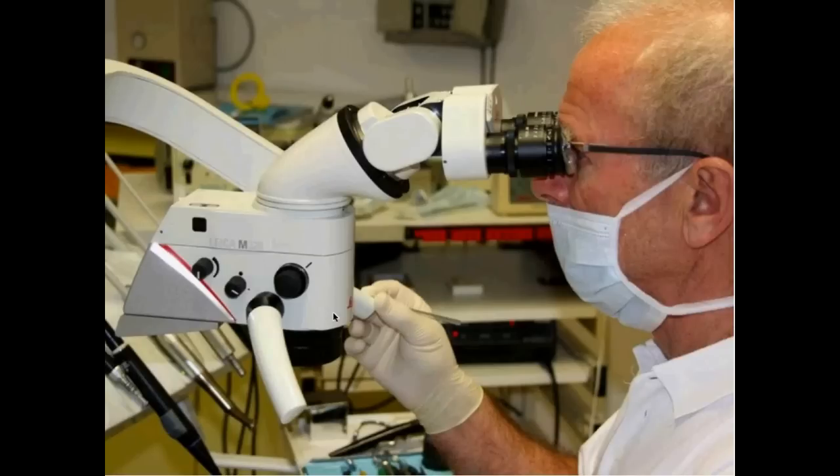How do you see the palatinal side with the microscope lens far from the patient's mouth? With a mirror. The microscope is always exactly 25 centimeters from the area you're working with. Mine, at least. You can, of course, have other lenses so that it might be 30 or 35 centimeters.